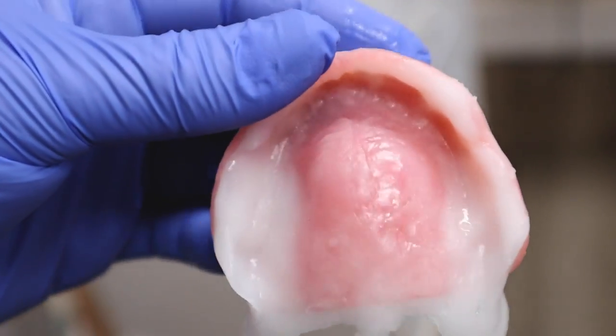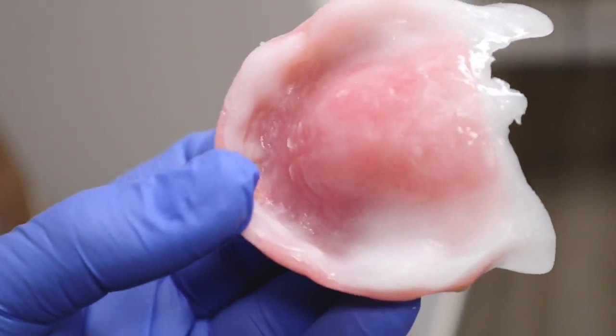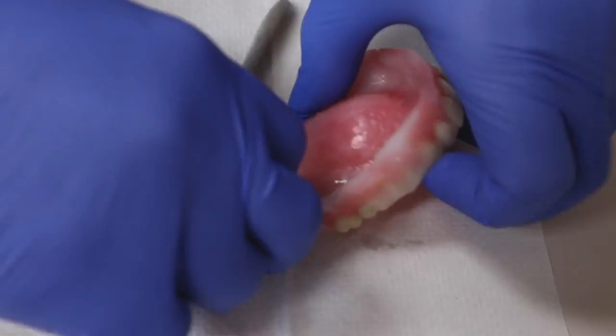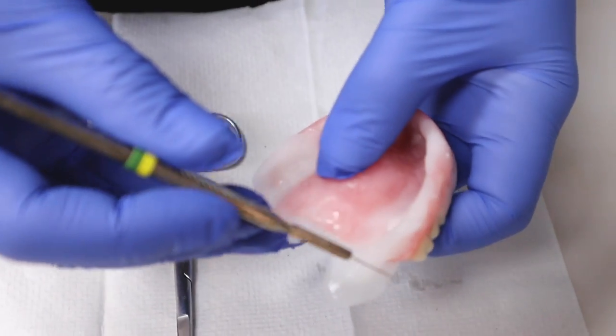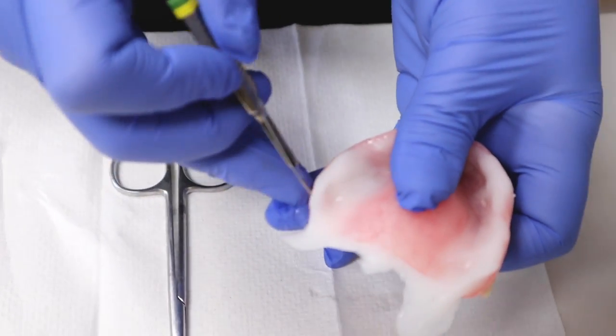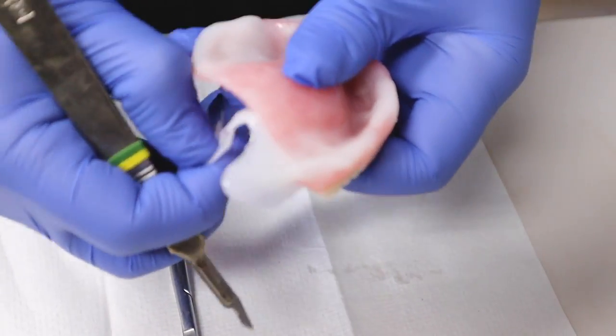The material is all set — this takes about eight to ten minutes. Now I go back to where material extruded and use a blade to cut it off cleanly. Using a burr is basically impossible for this, so the blade is the way to go. Be careful if you're in a rush — I have cut my fingers before. For the overall reline sequence: the initial reline is done on the day of surgery, another soft reline is done three to six weeks after, and then a final hard reline is done six months later, either chairside or sent to the laboratory.